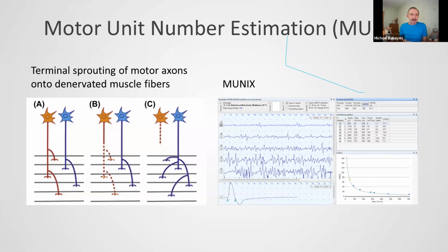But sometimes in some diseases, for example, maybe you know ALS, amyotrophic lateral sclerosis, we can get problems with many motor neurons in the spinal cord. A lot of motor neurons can die, can degenerate. But if we record the motor response, CMAP, we will get normal amplitude.